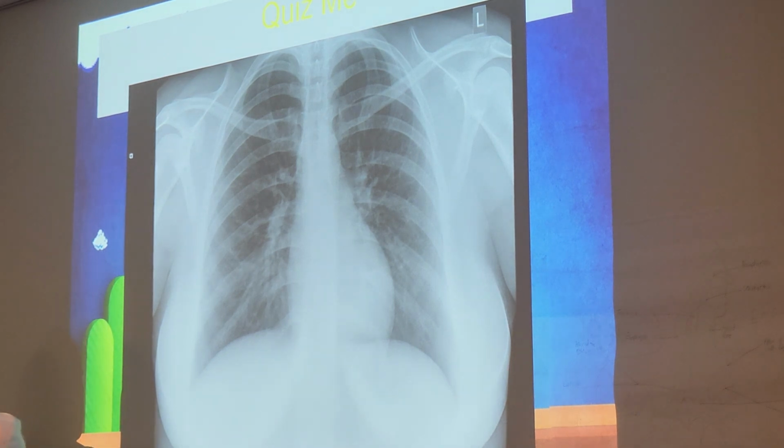So when it comes to that correction, what would be the opposite? How would you correct that? We would center more superiorly to include all the relevant anatomy. Is there anything else wrong with that radiograph?